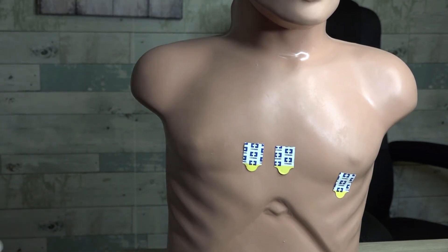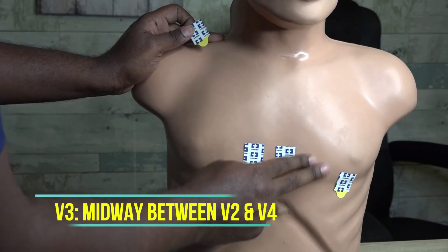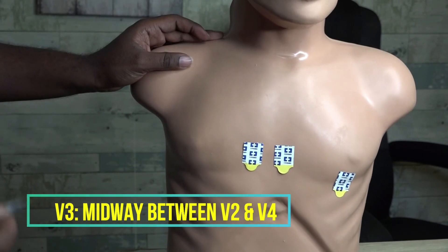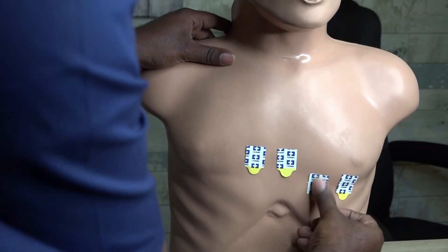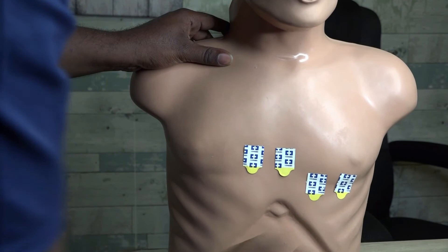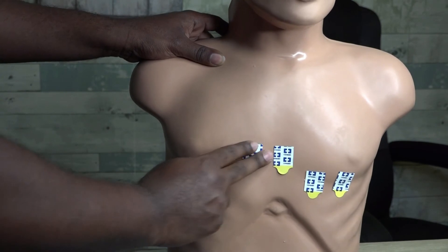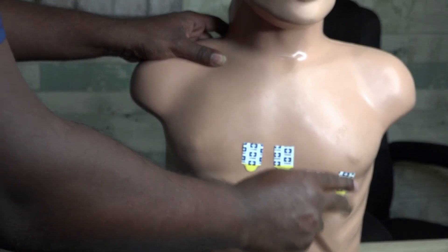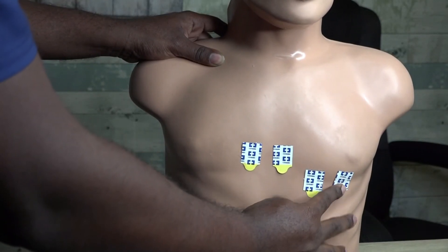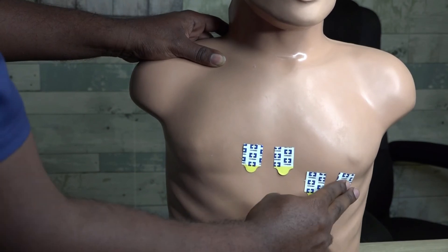Now we go to V3. V3 is located midway between V2 and V4, right in that middle space — that's where your V3 sticker is going to be placed. So V1 is right margin of sternum, V2 is left margin of sternum, V4 is at the fifth intercostal space in the mid-clavicular line below the nipple, and V3 is midway between V2 and V4.